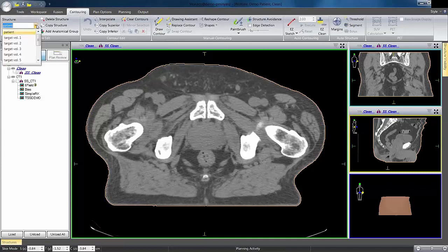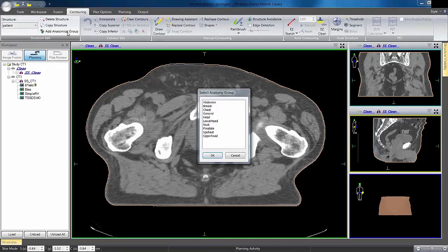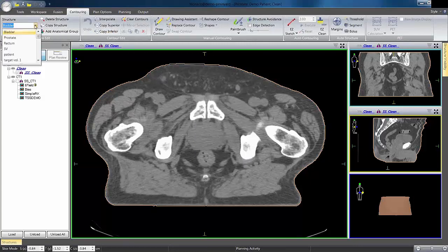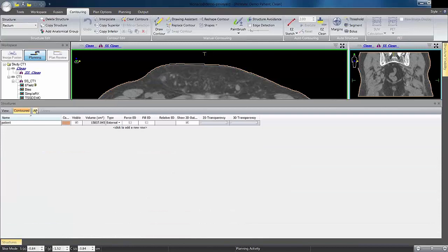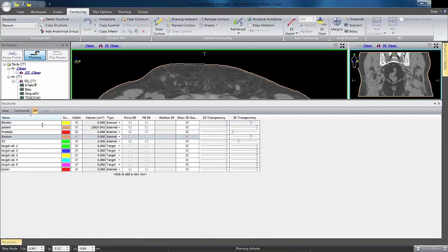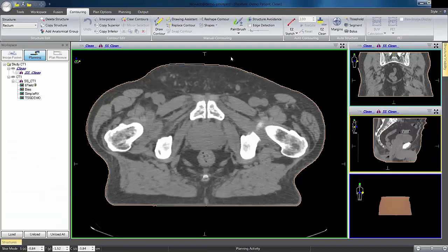If I come to my dropdown, you can see it doesn't load much when you first put the CT set in. It's very easy to add an anatomical group. I'm just going to grab the prostate. And now if I come up to my dropdown, you can see a number of structures have been added—the bladder, the prostate, the SV, and so on. I want to start with the rectum. It automatically assigns colors, and you can change them to pretty much anything you want.